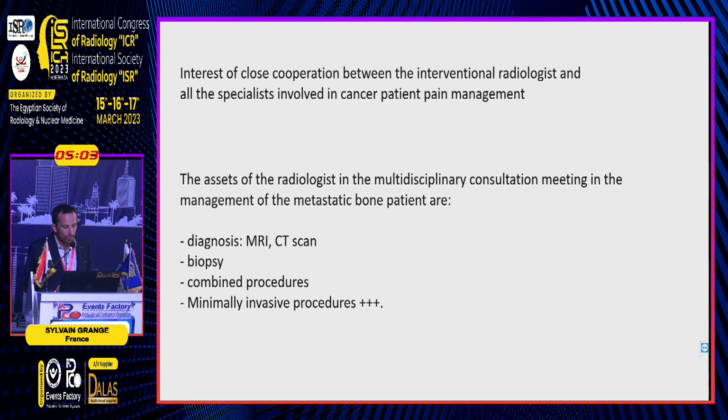The assets of the radiologist in the multidisciplinary consultation meeting in the management of metastatic bone patients are the diagnosis, because we are all diagnostic radiologists before being interventional. We can make biopsy. We can make combined procedures in one time, in one anesthesia, and the minimally invasive character of the procedures.